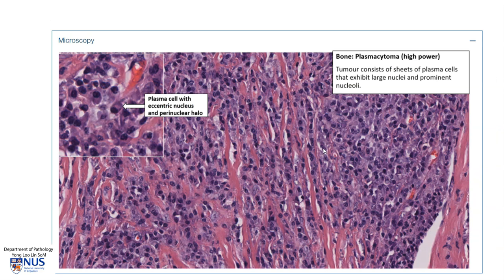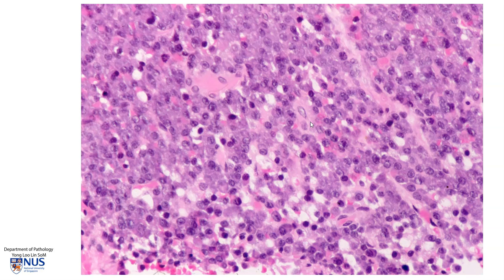Microscopically, plasmacytoma is characterized by masses or sheets of abnormal plasma cells, and the plasma cells can range in appearance from relatively mature — as you can see here, they very closely resemble normal plasma cells with a perinuclear hof — to cells that appear less mature or less similar to benign plasma cells. In this particular tumor, we can actually see prominent nucleoli in quite a few of these abnormal neoplastic plasma cells.